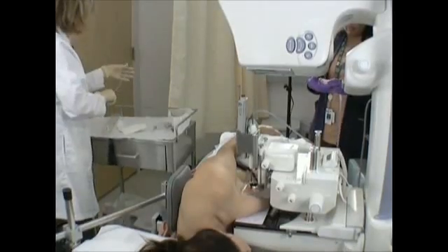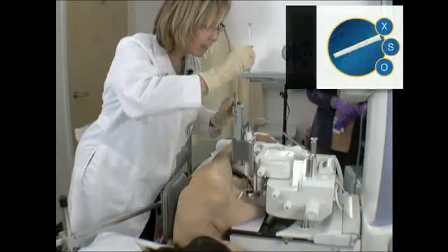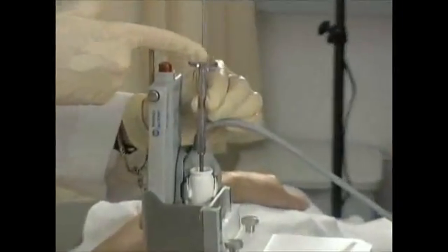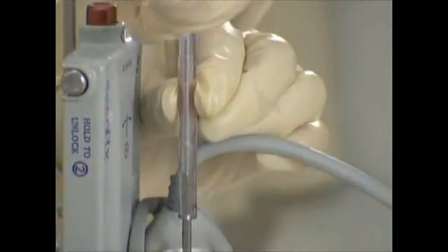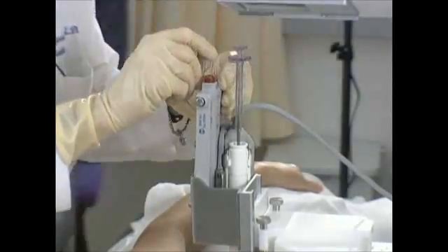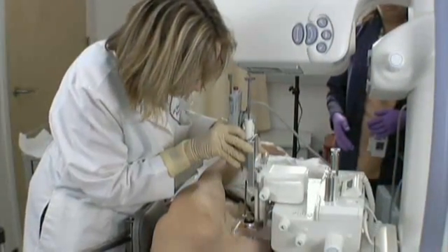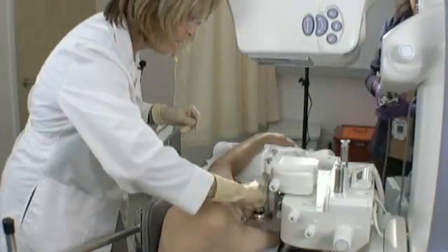It's quite simple to introduce the tissue marker into the breast, though it does require a steady hand. The important part is to make sure the yellow arrow lines up with the red arrow on the device so that the tissue marker goes out of the sample notch and not back into the needle. I plunge the tissue marker out, then Olga rotates the needle 180 degrees and I cock the needle. We take a stereo picture to confirm the tissue marker went out — it is in the breast, which is where we want it. I then pull the needle out of your breast, Karen.